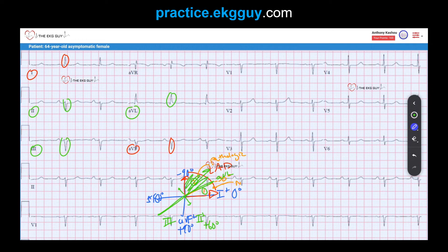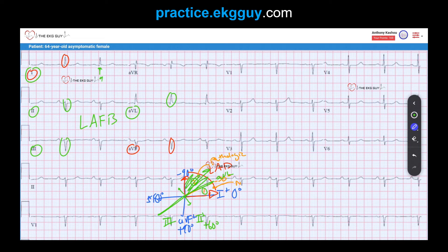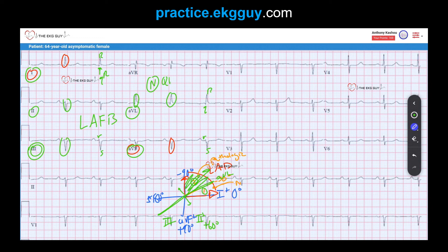With a pathologic left axis deviation, we should be thinking of left anterior fascicular block. Other findings that favor this diagnosis include QR complexes in leads I and AVL — there's a small Q wave followed by an R wave in both leads. We also see RS complexes in leads III and AVF — an R and an S in each. These are supportive features. The QRS duration in this case is actually normal, which also helps favor the diagnosis of left anterior fascicular block.